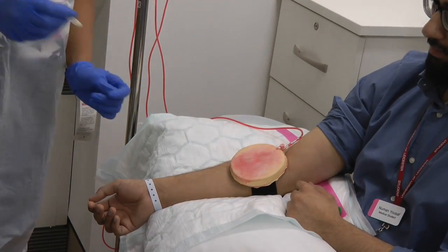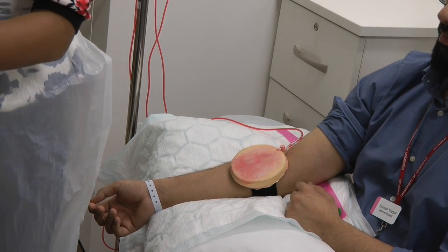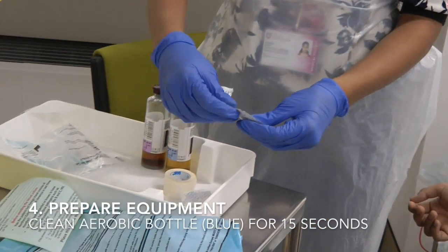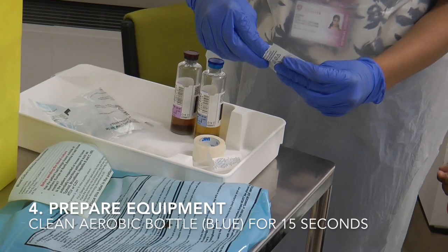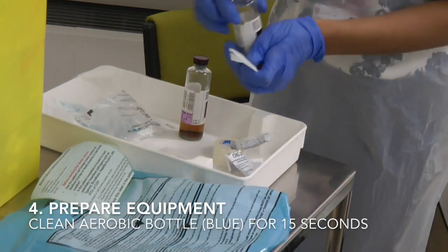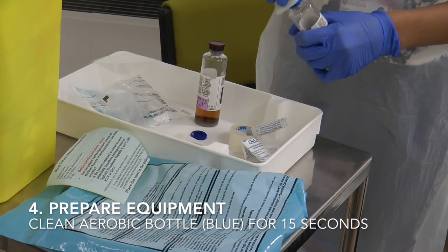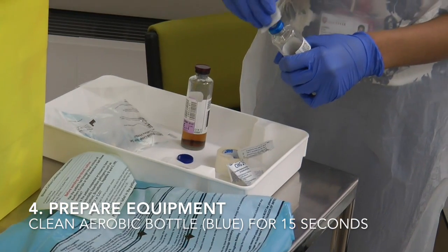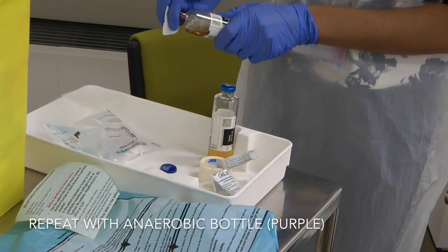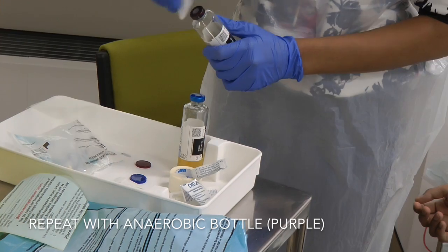I'm going to dispose of this in the sharps bin and get my equipment ready. I've cleaned the aerobic bottle top. How long are you going to clean for? 15 seconds. That's done. And repeat that with the anaerobic bottle. And that's clean. Thank you.